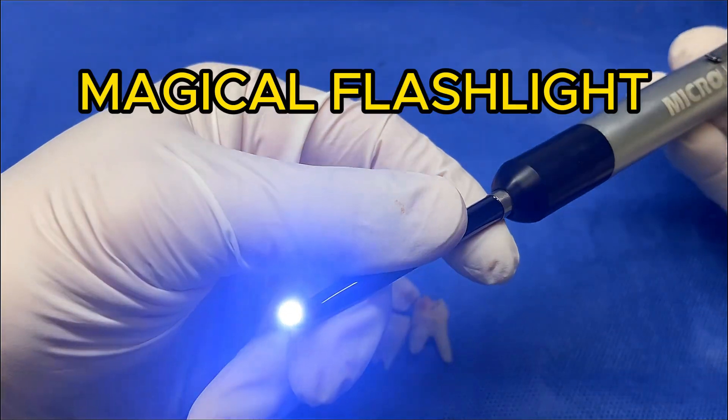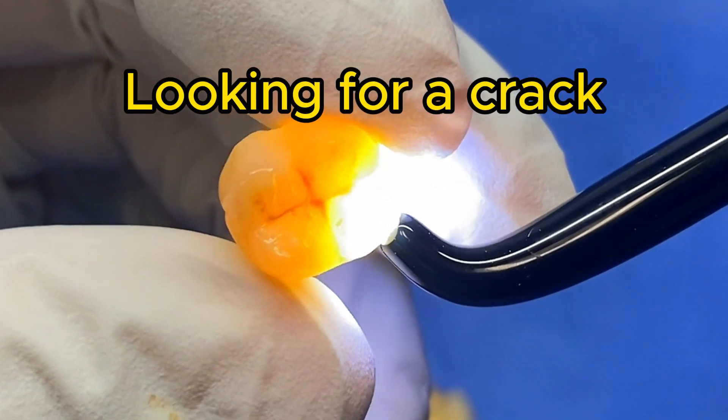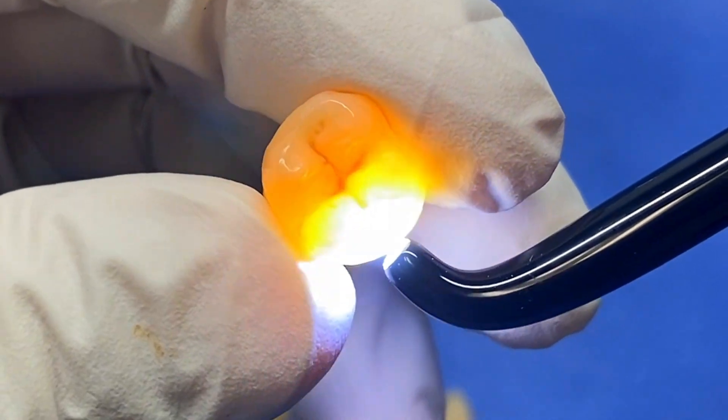What is this? Well, it's just a tiny little flashlight, but let's see what we're looking for. We take this little instrument and we're looking to see if there's a crack in the tooth. That's mainly what the indication for it is.